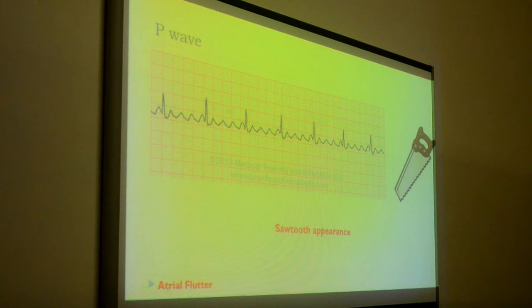Yeah, I know. It was 150. Now look at it. Now it's almost 75, 70. You took it from 150, you did carotid sinus massage, you dropped it to 75. That spreads the QRS complexes apart. Once you spread the QRS complexes apart, you can clearly see the P wave.